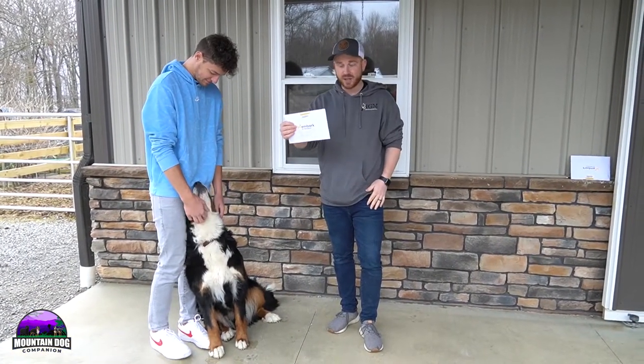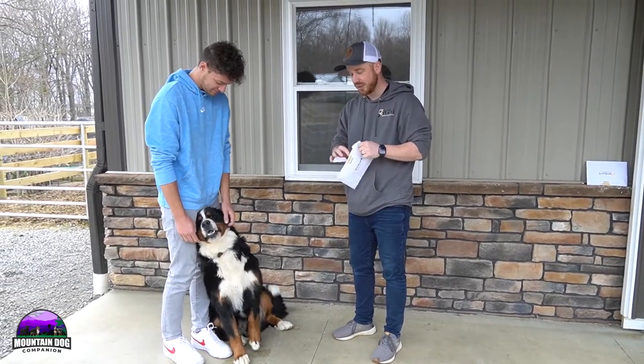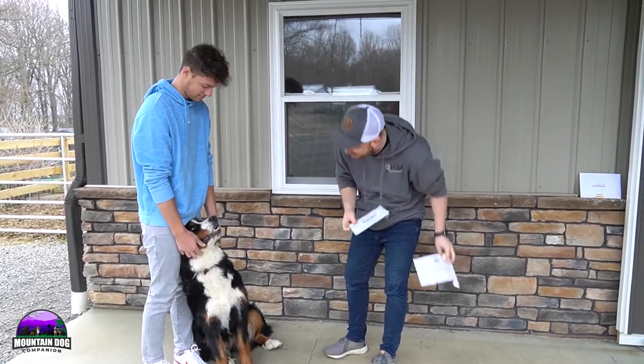Alright guys, we have our Embark test here ready to use on Millie, one of our Bernese Mountain Dogs. So we're going to do this for you to kind of share again how it's done. Good Millie, you're ready to get a swab.